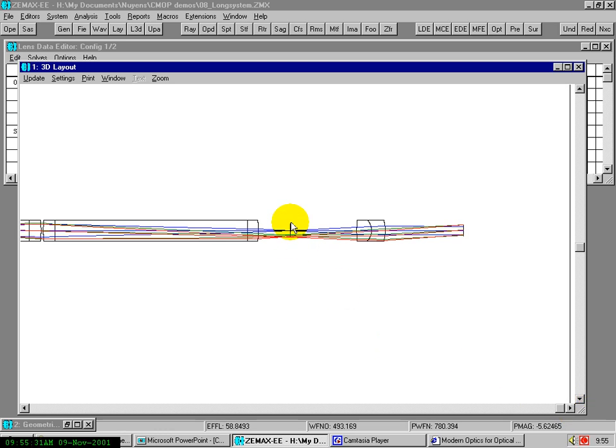And then here is an intermediate image again, and on this position one can put something to measure, for instance a reticle, but most important here is to put the field stop, to have a nice sharply defined region where one wants to look. And this image is observed through an eyepiece, and this will image it to somewhere here, far away, so you can easily observe it.